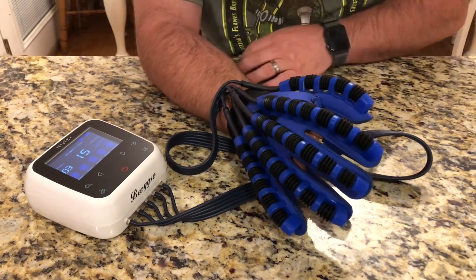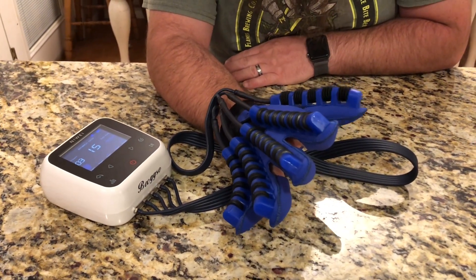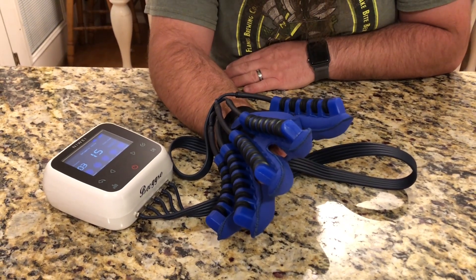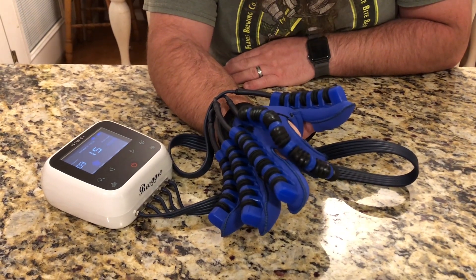Now I'm gonna try out the automatic cycle function. It's doing one finger and stretching all of them — it looks like it's just gonna cycle through my fingers automatically.